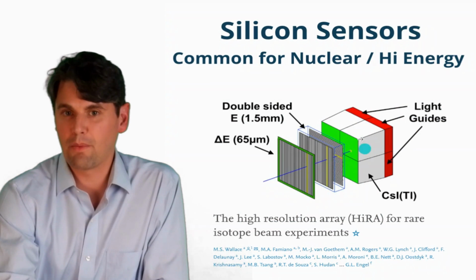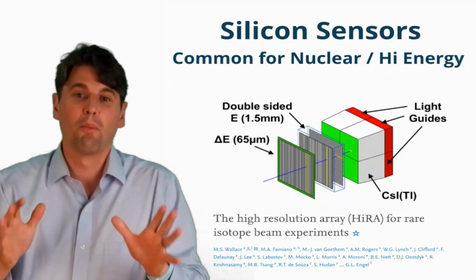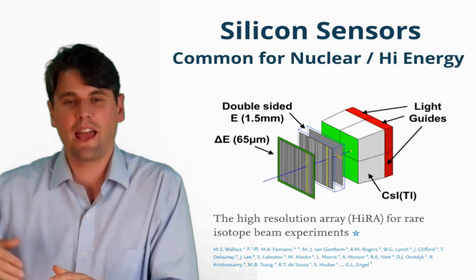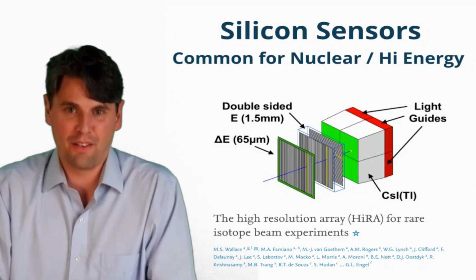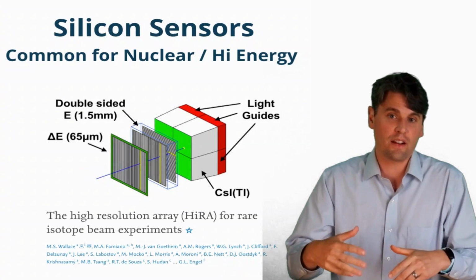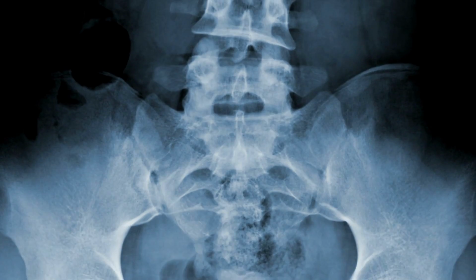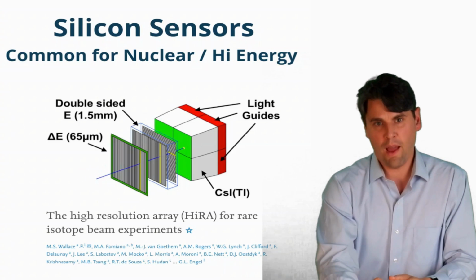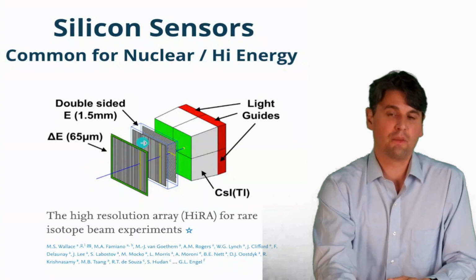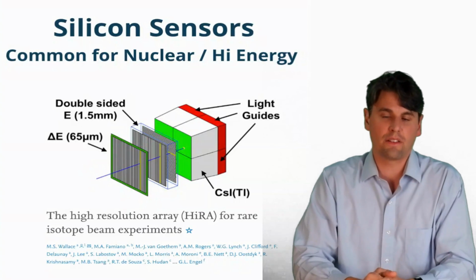And then you would have another material here, which is a scintillation material, more like the traditional detectors in CT, and they would have all of the energy of your charged particles deposited there. Silicon actually has a lower cross section for interactions with our medical x-rays. So if you have a detector like this, most of the energy would pass straight on through and wouldn't be deposited in your detector.